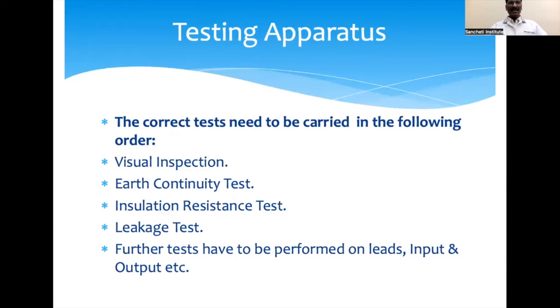Then coming to the actual part of testing. I have seen that every teacher has their own method of testing apparatus. When I went through several tests of electronic apparatus, I found that this is the most appropriate method to test the machine. It has the following components.